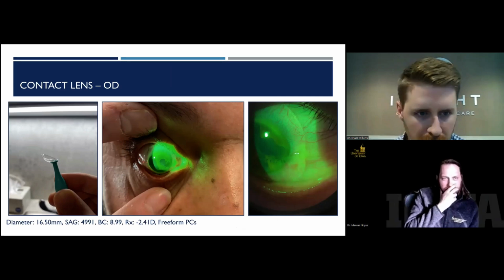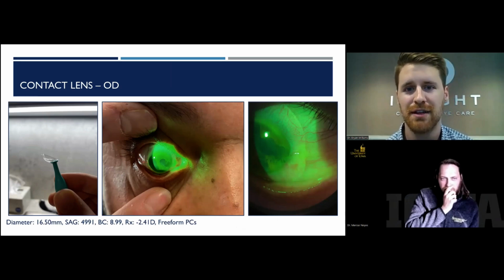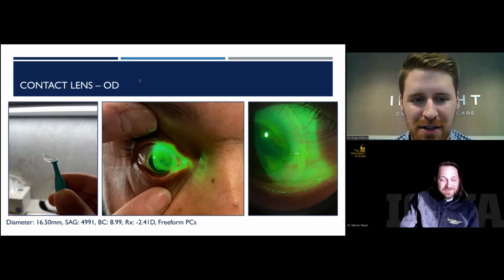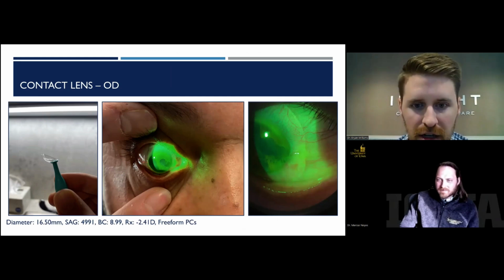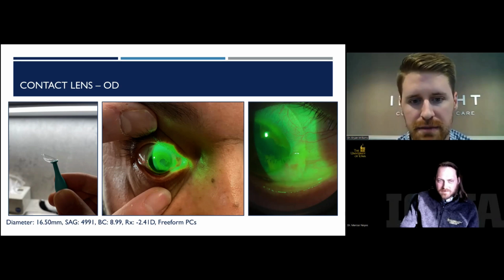So the lens right there, you can almost see it's, again, we're ramping up here. So take this with a grain of salt as you get used to Marcus's lenses that are like this on the sclera. But you can see that little bit of where the pinguecula and scar tissue goes into nasally. The iris even had some damage and trauma to it too from that full thickness laceration of that work injury that he had. But really with the lens on that we designed, it's really contouring that nasal sclera very well. And the initial comfort dispensing the lens to the patient, he was happy with.